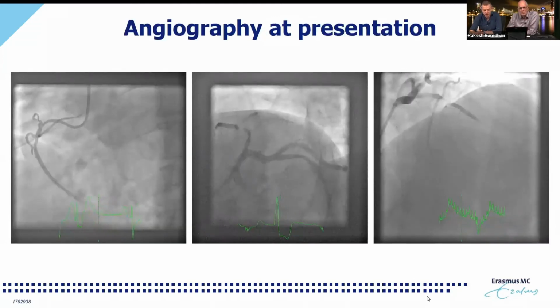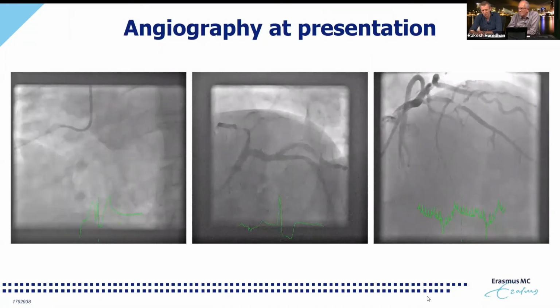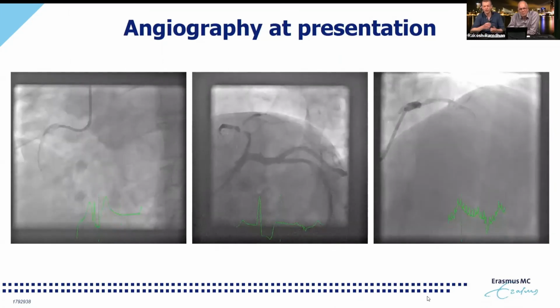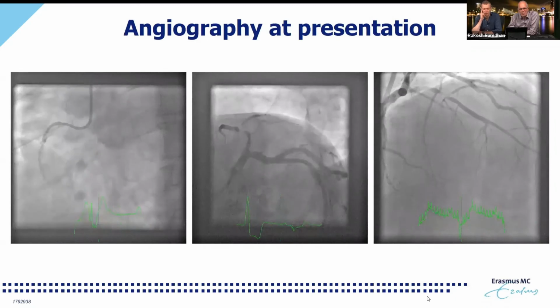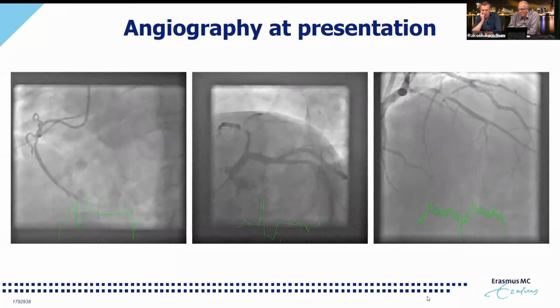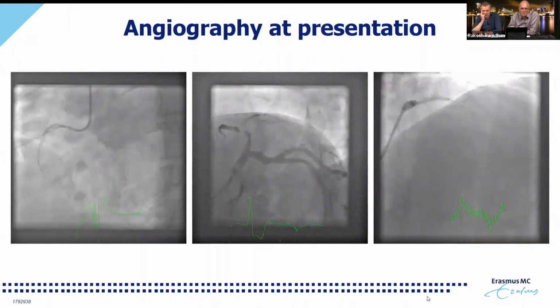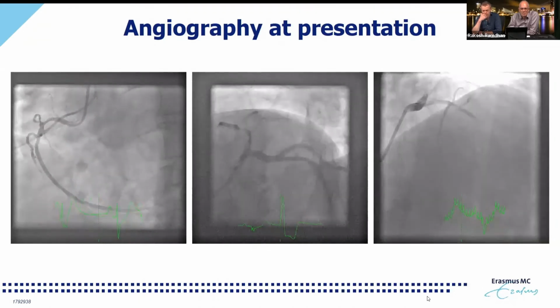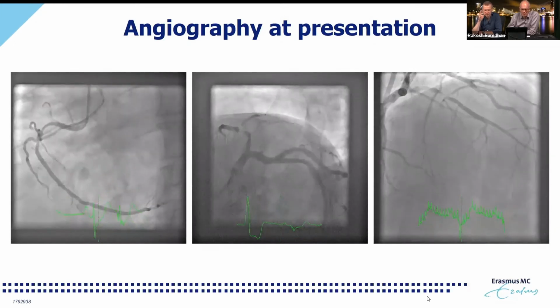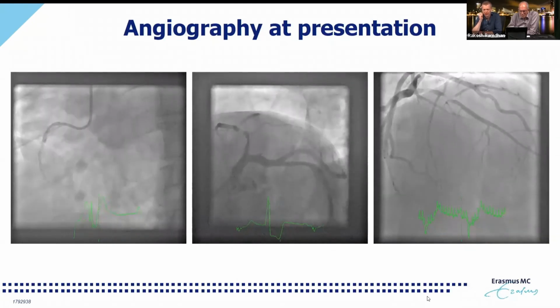And then this was the angiogram, again a right dominant system with a lesion in the proximal right. Not too much backflow of the catheter, so it's not really clear, at least to us who reviewed this case offline post hoc, whether this was spasm or a lesion. But then the interesting part was in the LAD. The left main and the circumflex actually look nice, but in the LAD you see this inhomogeneous, tight aspect of a lesion, subtotal in the proximal part of the LAD.